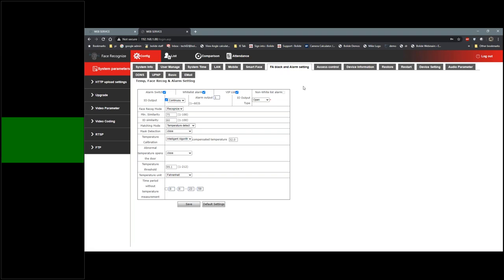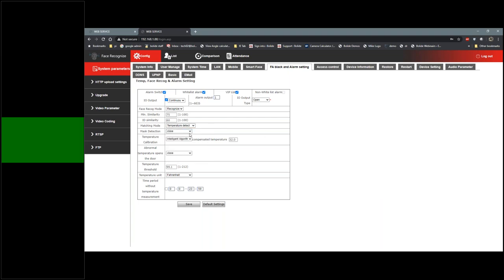The next menu is equally important — it tells the camera what you're detecting: faces, temperatures, ID. You can do RFID, face, and temperature together. You can do just the whitelist, or different combinations. You can detect by face recognition, temperature detection, ID card reading, or different combinations of all. Right below that you'll see mask detection. It will detect the face and whether you're wearing a mask or not. It detects your face, knows who you are, and whether you're wearing a mask — not just one or the other.